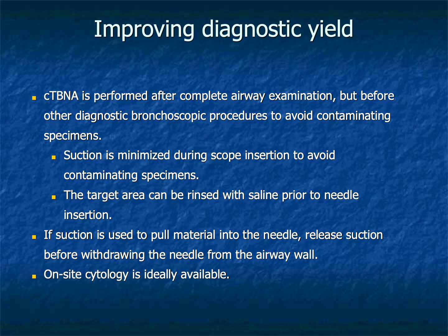Whenever available, rapid on-site cytologic examination, also referred to as ROSE, remains one of the most effective ways to improve diagnostic yield while avoiding unnecessary needle passes.